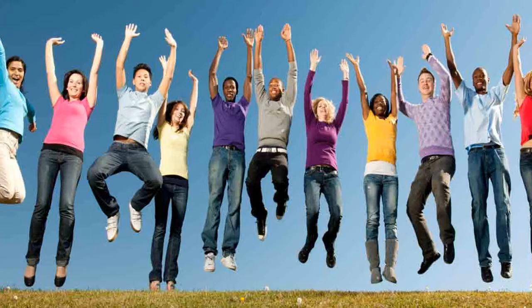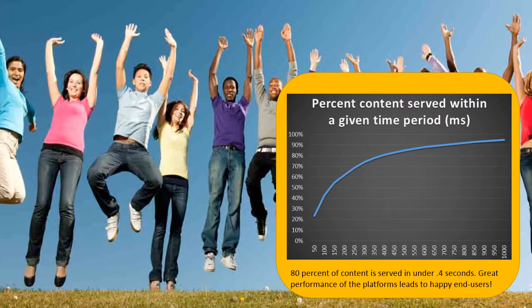At the end of the day, the question is if this is something worth investing in. There are obvious payouts on the institutional side. WSI supports flexible and cost-effective distant learning and augments problem-oriented teaching. That's good news. The better news, actually, is that students really like and appreciate this type of technology.